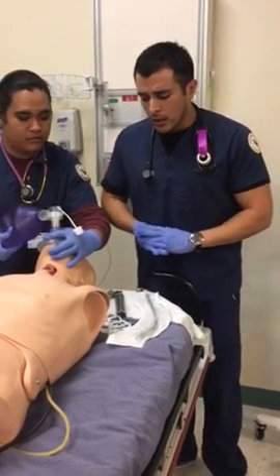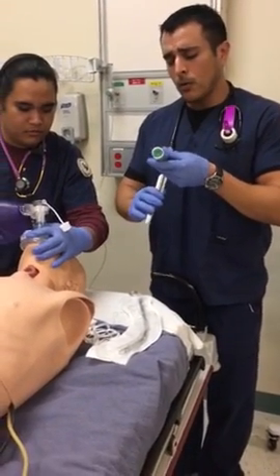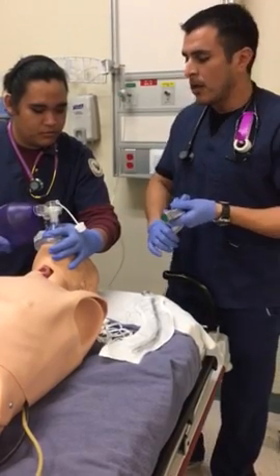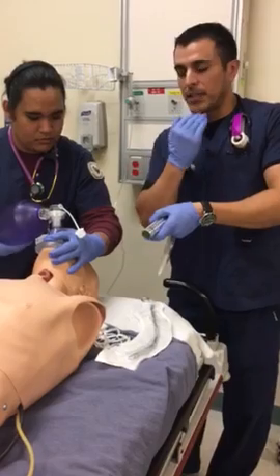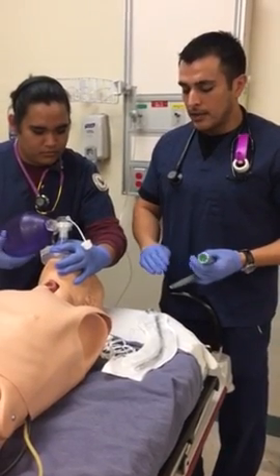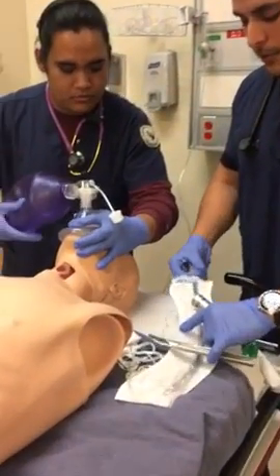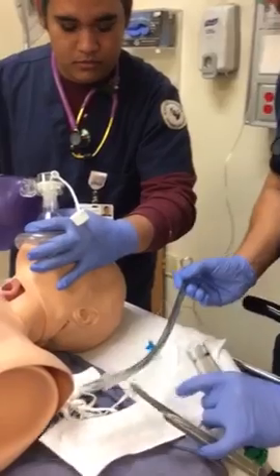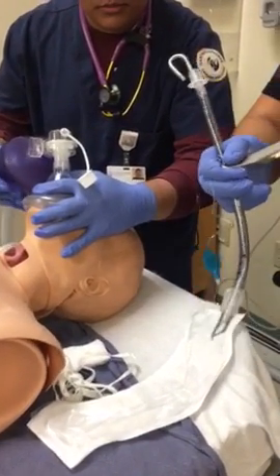When I do this, I want to hold the handle in my left hand and insert the tube with the right. I'm going to be going in from the right side and coming to the left to displace the tongue. And it's coming up here to where I'm going to do my attempt. So I would let my partner know.